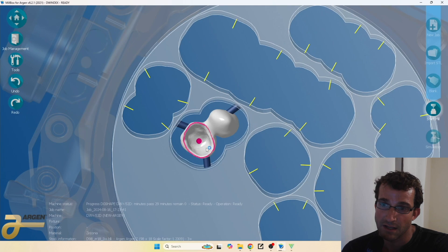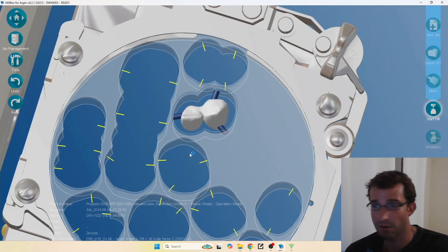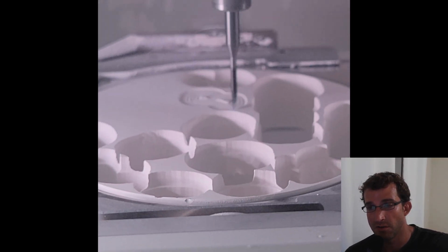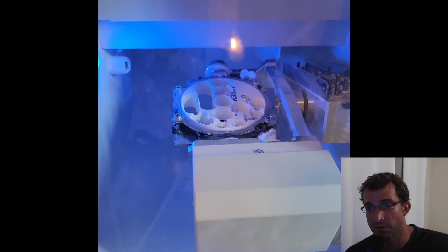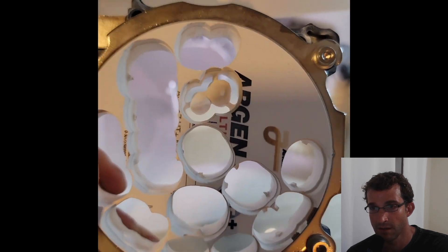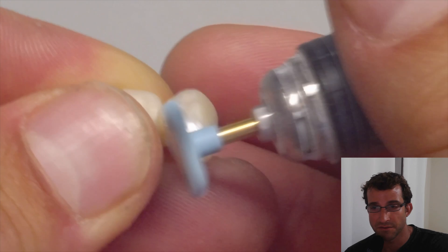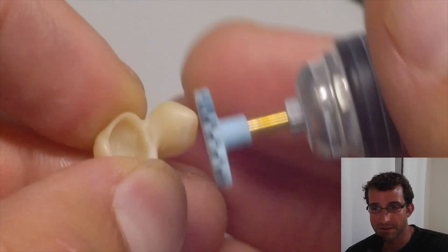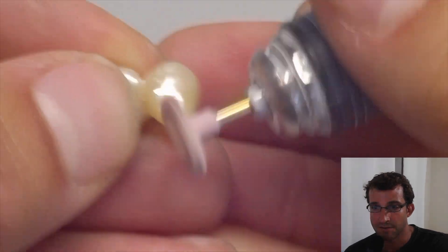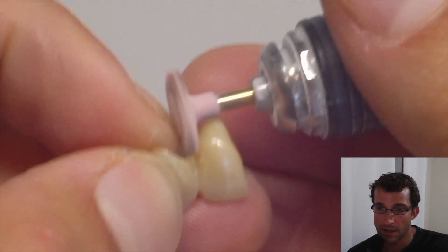Here's the unit in the mill box before we mill it out — it's about an hour or so milling job. There's the mill at work. We'll mill it out, give it an hour, come back, cut it out of the block. Here's the block right after milling. We'll de-sprue it, then put it in the furnace overnight — about 8 hours. Then we'll give it a polish with ceramic polishers on the lab handpiece.